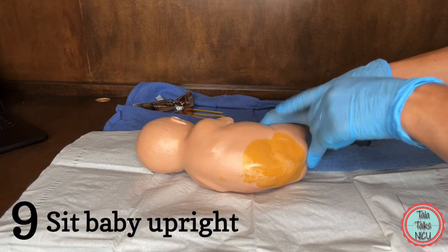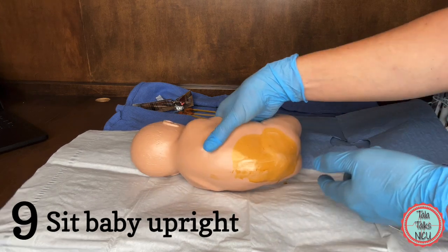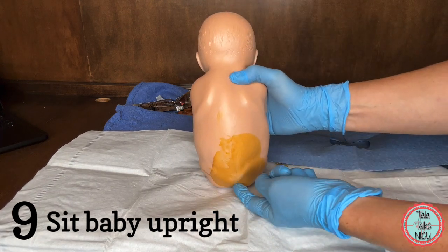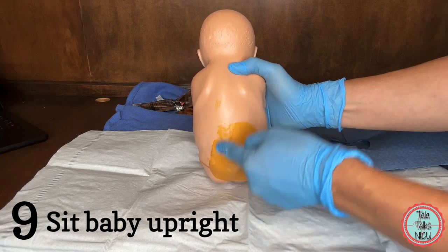Nine: let's say you've tried a couple of times and it's not working in this decubitus position. Try sitting the baby upright. This position widens the gap between the spinous processes and it will make it a lot more likely that you're in the midline.